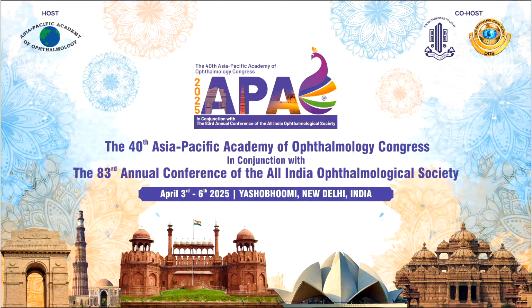David, your take on using Zepto in these cases? Yeah, in the United States, Zepto is another way to do an automated capsulotomy. It uses a nitinol ring with some electrical pulses to mechanically, almost like a cookie cutter, create an instant rexus. So for those of us that have it, that's my favorite for a white cataract.